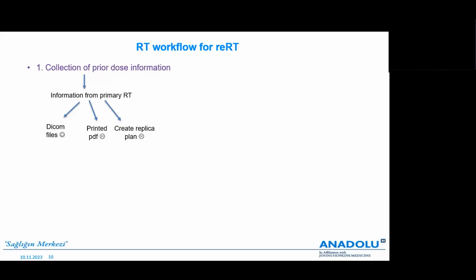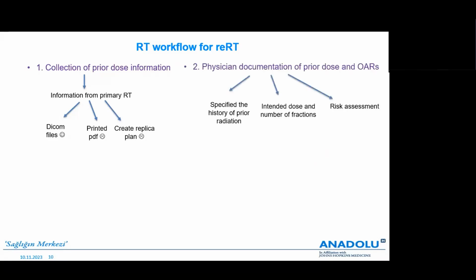Just imagine, just understand the dose value, and then try to evaluate the replan. So this is maybe helpful to you. So you can do this. This is something about the prior dose information. And what about the doctors?